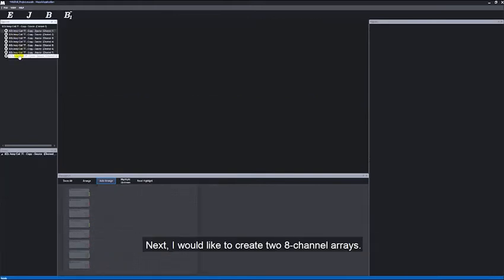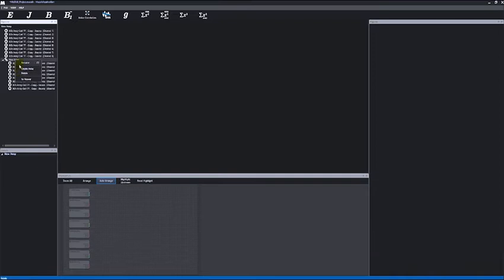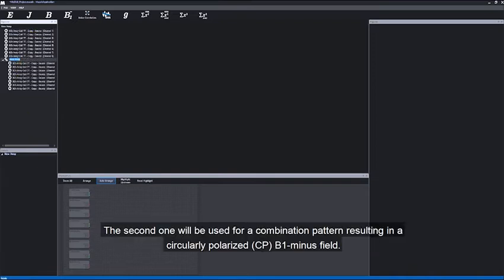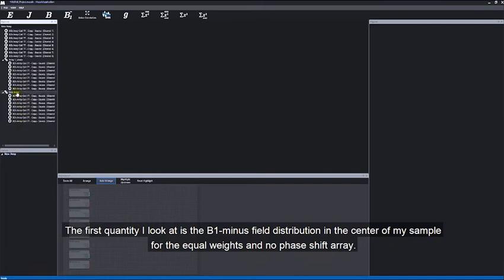Next, I would like to create two 8-channel arrays. The first one will be formed of a linear superposition of all channels with equal weights. The second one will be used for a combination pattern resulting in a circularly polarized B1 minus field. The first quantity I look at is the B1 minus field distribution in the center of my sample for the equal weights and no phase shift array.